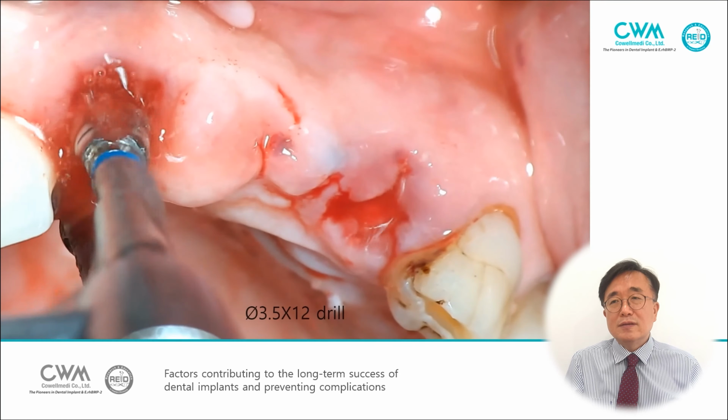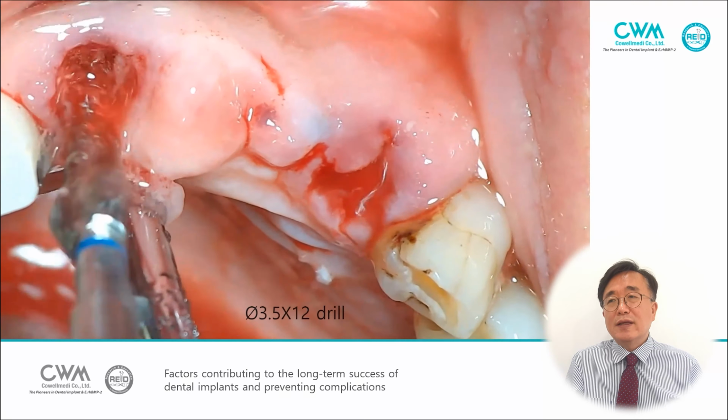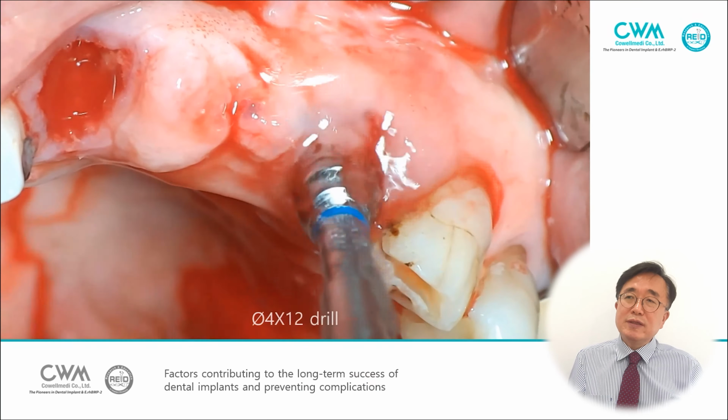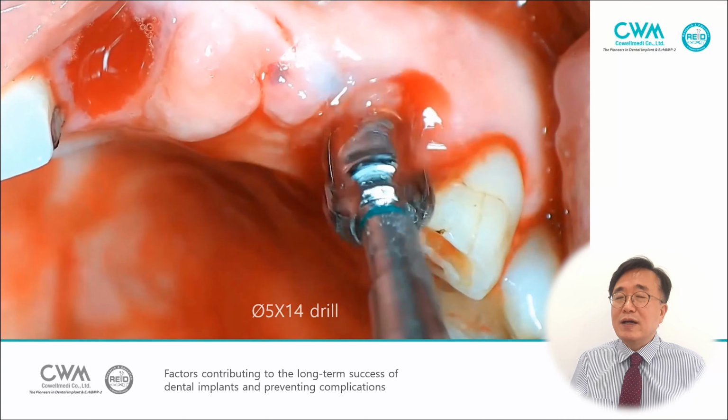Here, just stop, maintain, coincide with the gingival crest. And diameter 4. Finally, diameter 5.